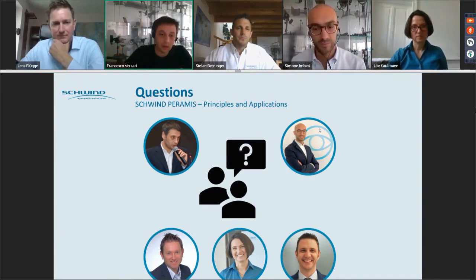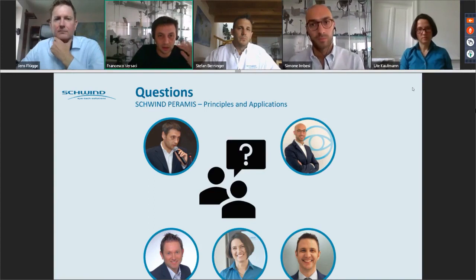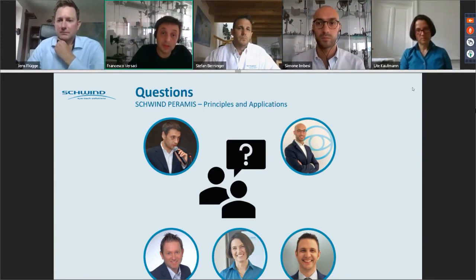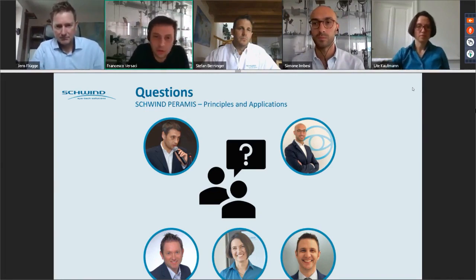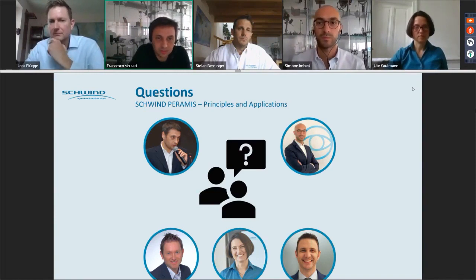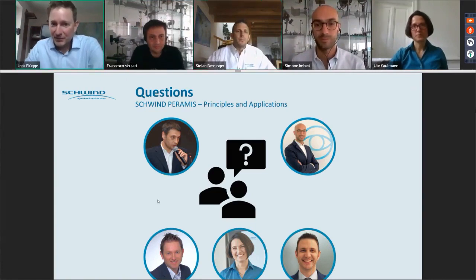If you are thinking of a corneal aberration treatment, in this case, you might take into account the two surfaces of the cornea. So instead of using the front corneal wavefront, you might use the total corneal wavefront that is derived by raytracing from the first and the second surface. But I think that Simone is going to talk about this in his speech. Okay, thank you. All right, perfect. Thank you very much, Francesco.